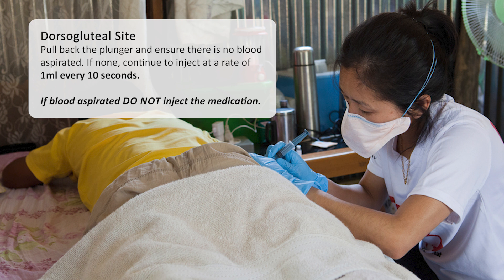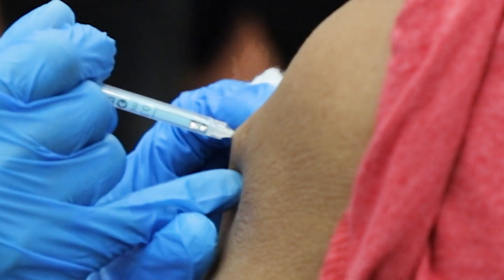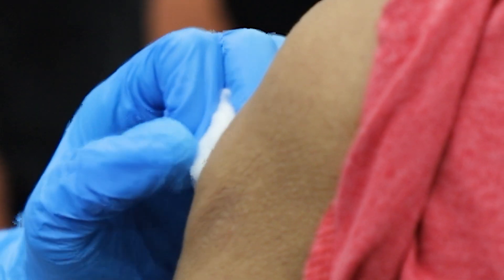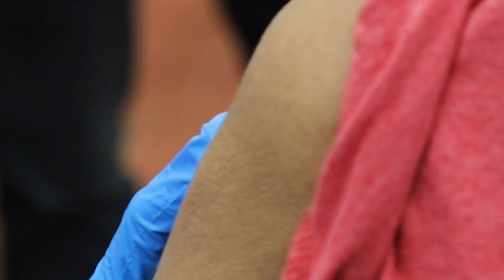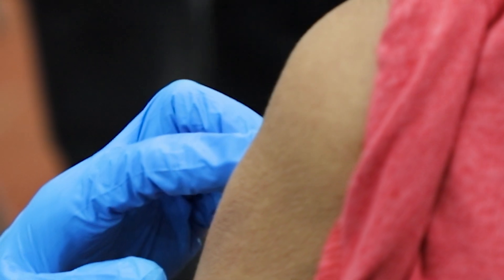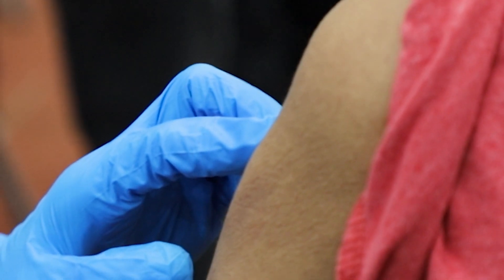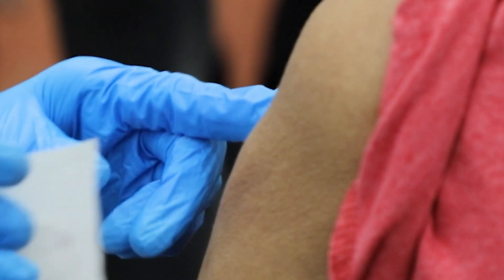If blood is aspirated, do not inject the medication. After waiting 10 seconds, rapidly withdraw the needle at the same angle of injection while releasing the skin and subcutaneous tissue with the non-dominant hand.